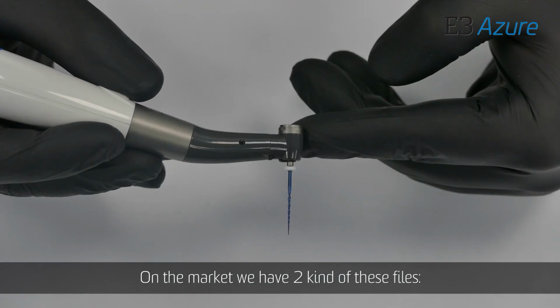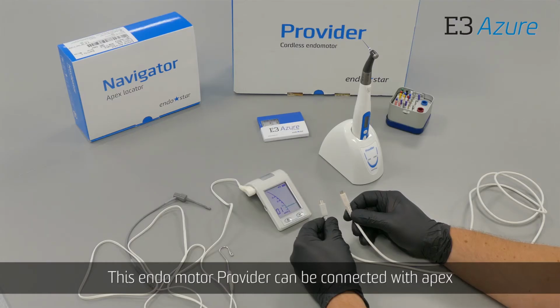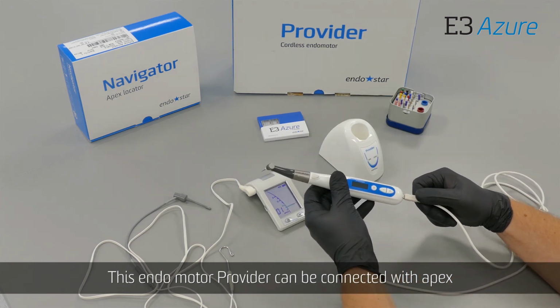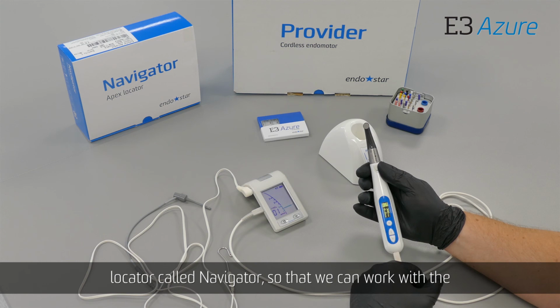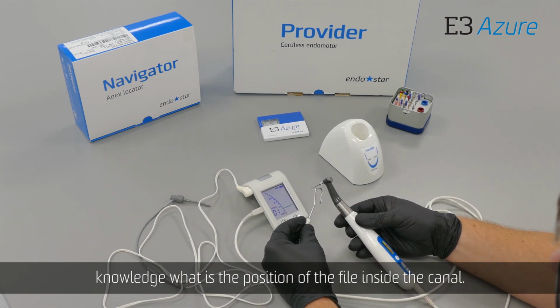On the market we have two kinds of these files, Reciproc and WaveOne. This endomotor can be connected with an apex locator called Endostar Navigator, so that we can work with the knowledge of what is the position of the file inside the canal.